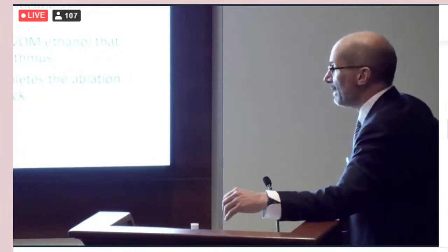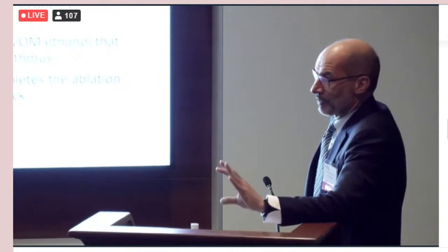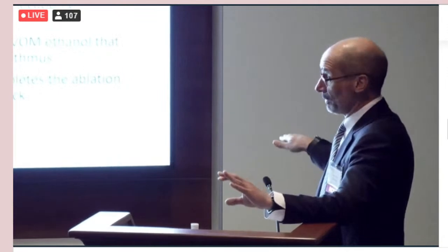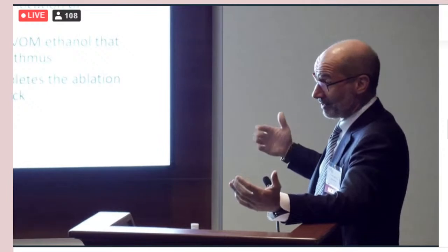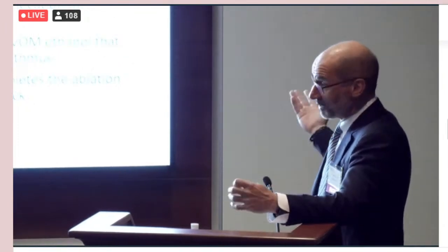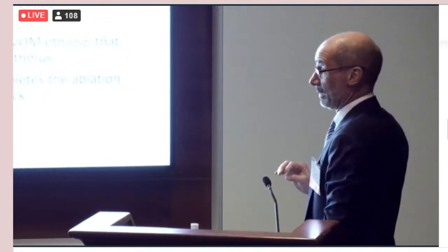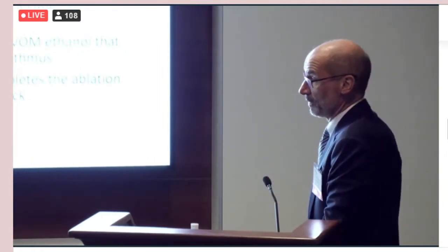So yeah, if someone does a mitral isthmus ablation endocardially, and they're thinking about going into the CS, but they don't know whether to go into CS or to give alcohol, I beg them to let me do the alcohol first, so that the CS may not be needed. Although the truth is that if you need CS ablation, alcohol probably would not prevent you from needing it, because the CS is not really taken care of by the alcohol injection due to the dead space of the balloon.